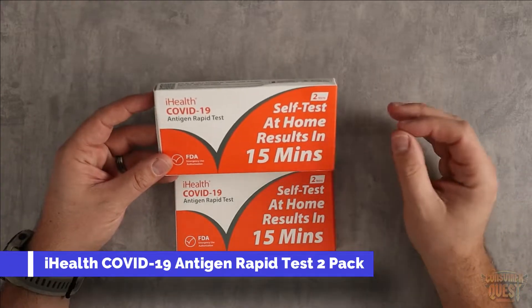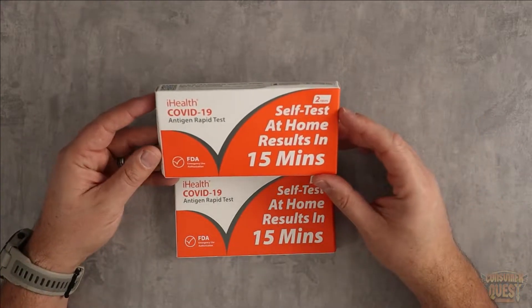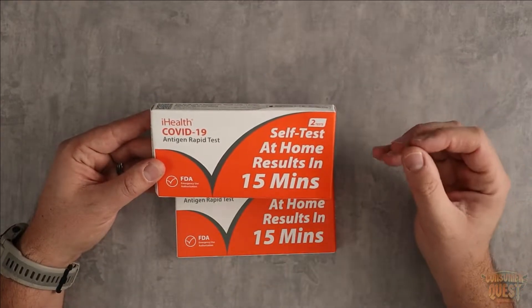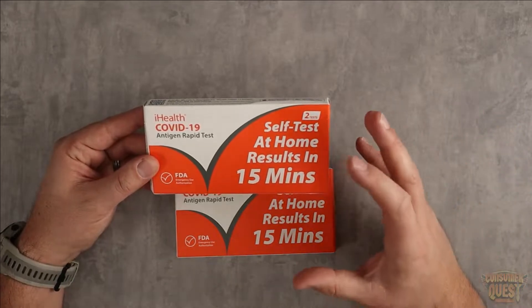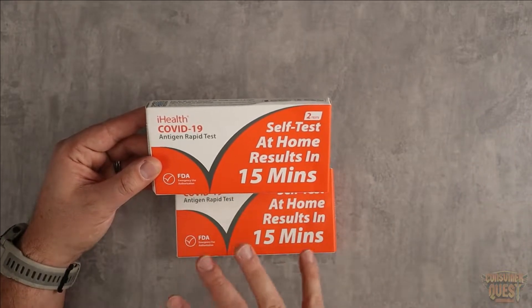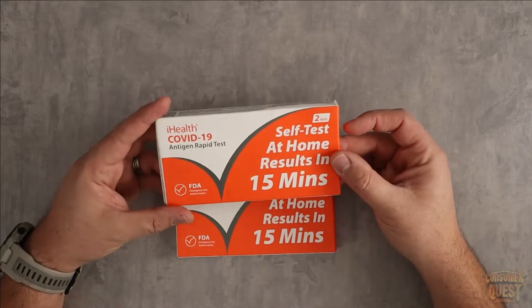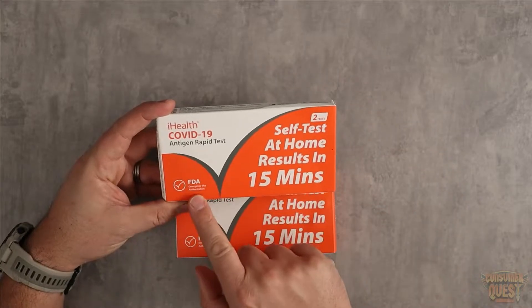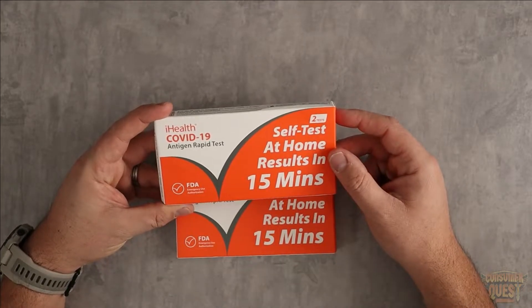Today I want to show you the iHealth COVID-19 antigen rapid test. These are the rapid tests — not the prolonged ones accepted by a lot of places. But if you wanted to test yourself and have something that works with the rapid test, these are two tests you can self-test at home with results in 15 minutes, FDA approved, emergency use authorization.